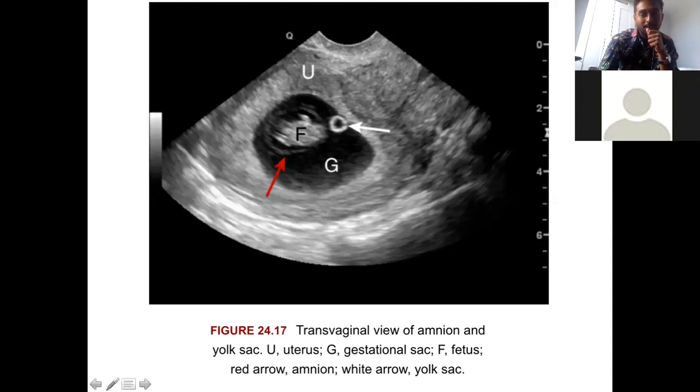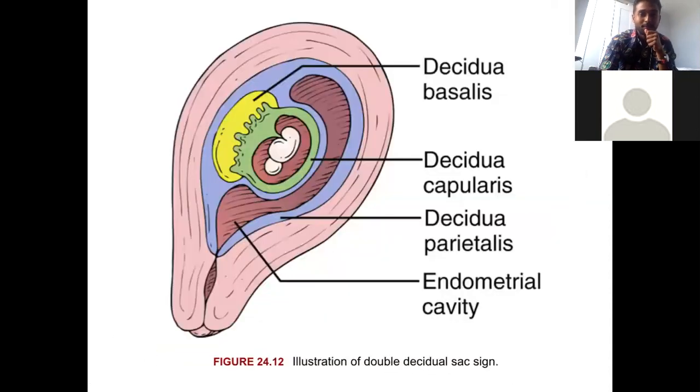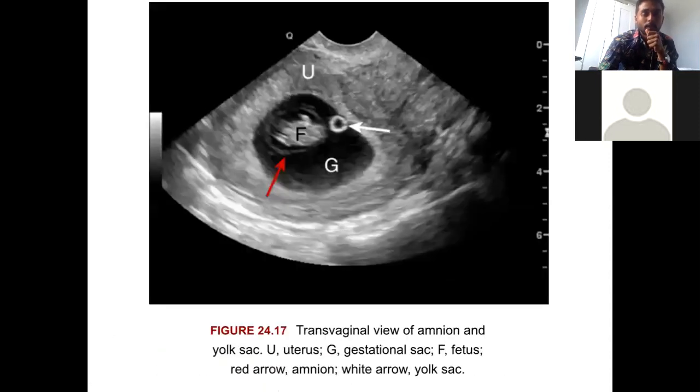At this point, you should hear a heartbeat. And that's another thing. I'm just gonna show it one more time. So this, it's two sacs. This is gonna end up becoming the amniotic sac. And then you're gonna have the yolk sac. Actually, look up another picture, a better one. You'll see what I'm talking about. It starts off with two bubbles. The amniotic sac keeps getting bigger. The yolk sac keeps getting smaller. And then the amniotic sac has the fetus.